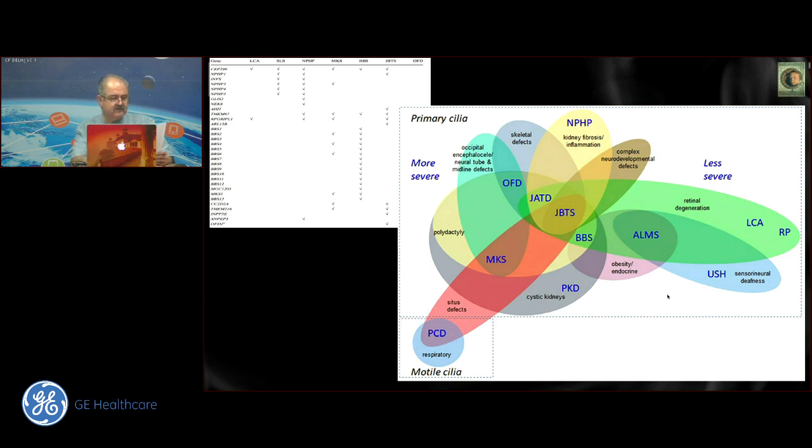That finishes with this. Yes. In fact, when you find kidney disease with polyhydramnios, there are two differential diagnoses. First, you see whether there's a left kidney, because sometimes a dilated left kidney can actually be sitting on top of the gastroesophageal junction and interfering with fetal swallowed fluid passing into the fetal stomach. And therefore you find polyhydramnios.